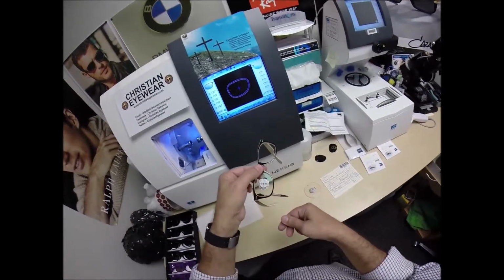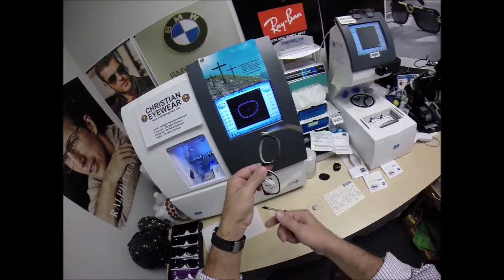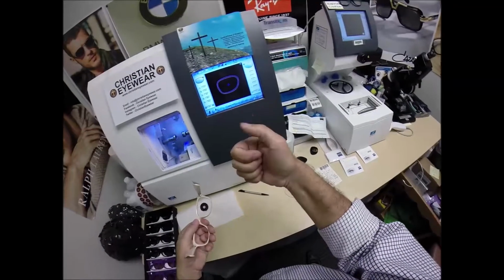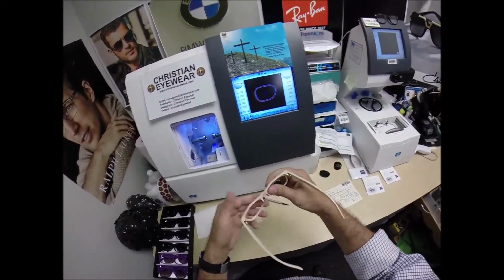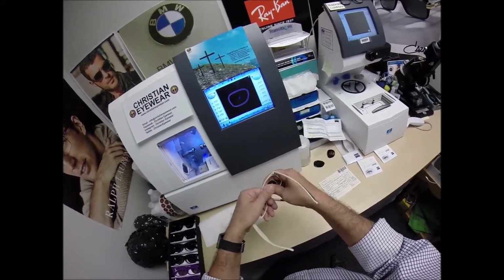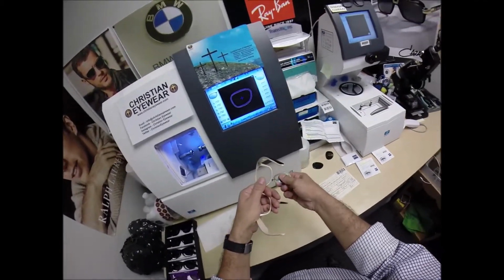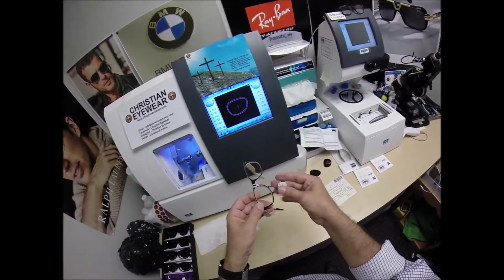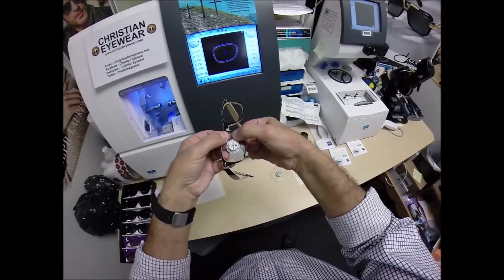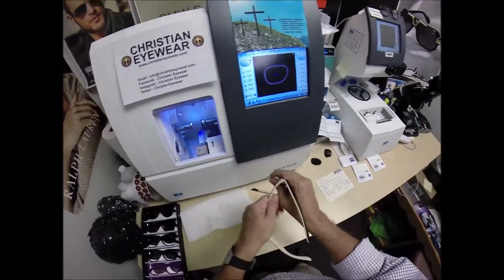Now, should you ever need to change the lens, to take these lenses out years from now, go back and hit rewind on this video. You turn the frame where the temples are pointed upward. I tell everyone, thumb your nose at the idea, with your thumb at the nose. You can put your fingers on top so it doesn't fall. I torque the frame a little bit with my hand, but I put this thumb on top of the other thumb and push down. You're always going to push down with your thumbs. To put them in, I turn it right side back up, tuck it in at the outside corner with the thumbs pushing downward. You heard that somewhere before, didn't you? It snaps right in.